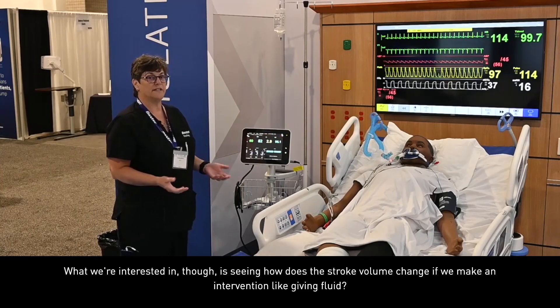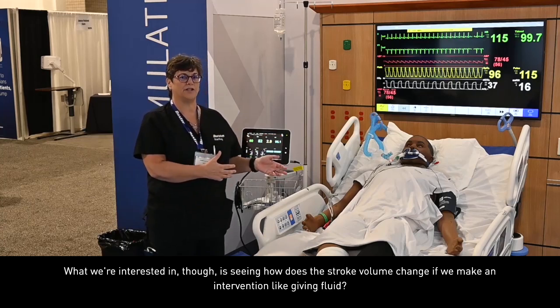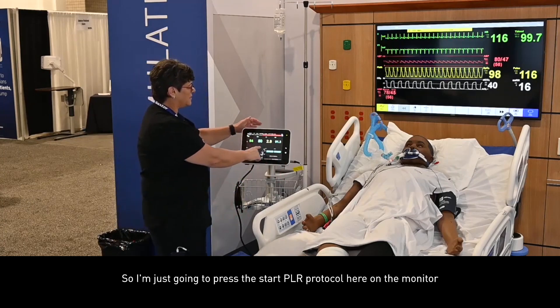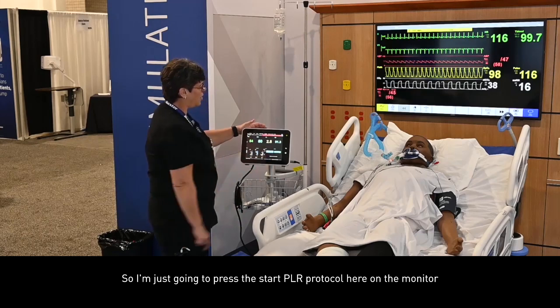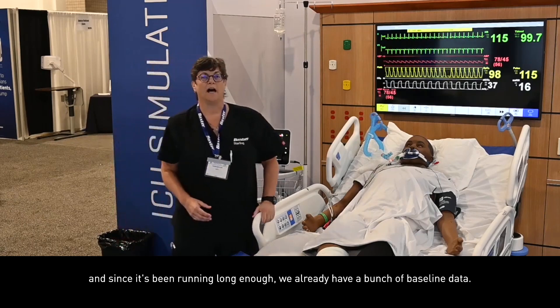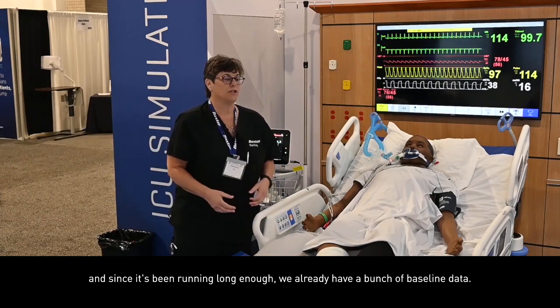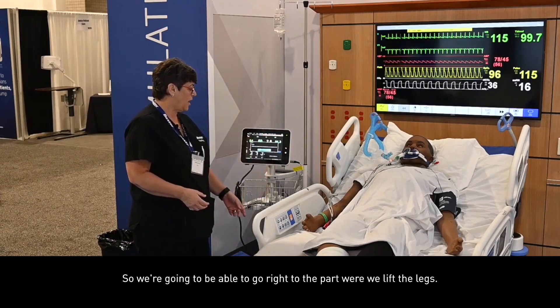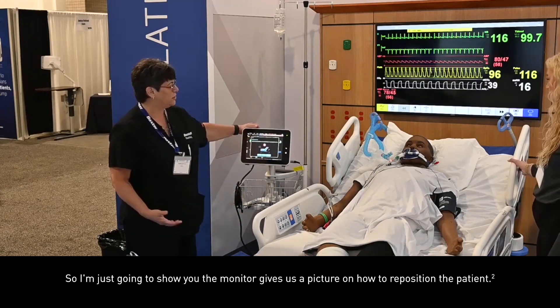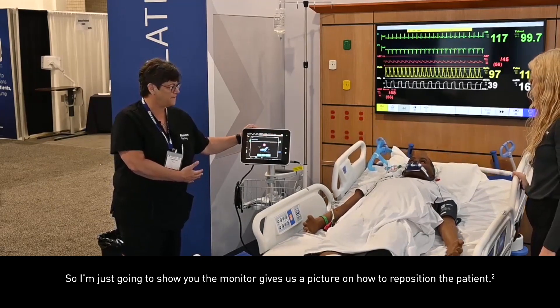What we're interested in is seeing how the stroke volume changes if we make an intervention like giving fluid. I'm going to press the start PLR protocol here on the monitor, and since it's been running long enough, we already have a bunch of baseline data. We're going to go right to the part where we lift the legs. The monitor gives us a picture on how to reposition the patient.